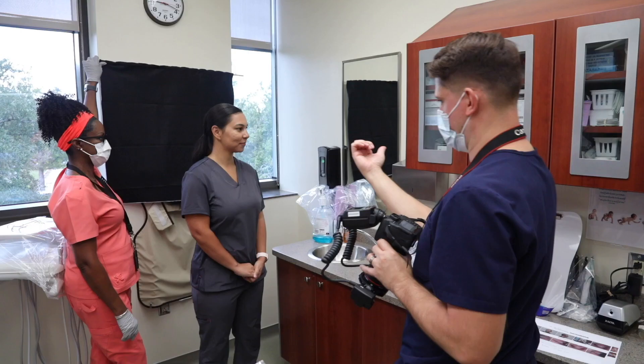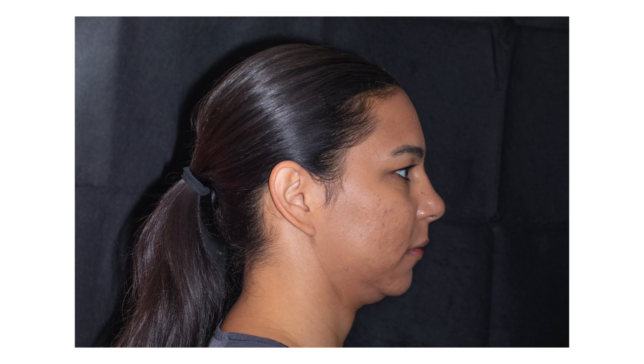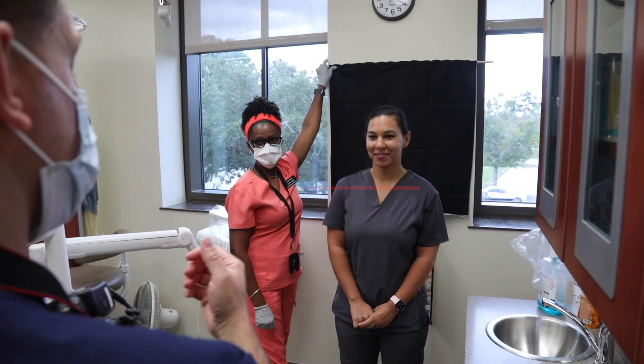For the profile image, have the patient turn to their left, your right. I prefer the patient to face their left in the profile photo. We want to capture from the clavicles up to the top of the head, and the ear becomes the center of the image. The patient will look straight ahead with the head as parallel to Frankfurt Horizontal as possible. Frankfurt Horizontal is an imaginary line that runs from the tragus of the ear to the bony infraorbital rim area. The patient's lips are in repose, being slightly apart and relaxed. I will typically focus on the corner of the eye.